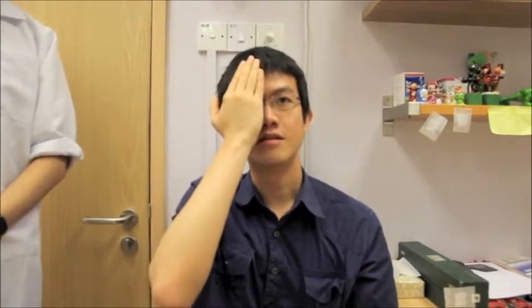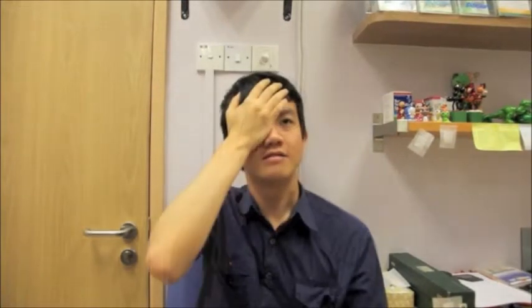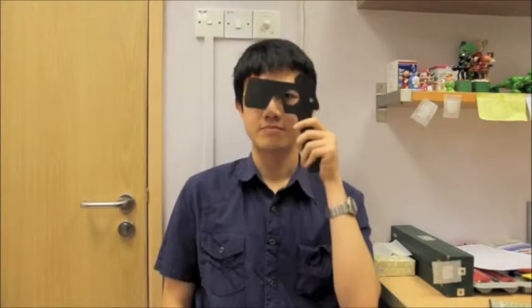Check the visual acuity one eye at a time by having the patient cover one eye while testing the other. He may use the palm but not the fingers, as one may see through the gaps between the fingers and render the results inaccurate. Take care that the palm does not press into the covered eye, as this will blur the vision when the eye is subsequently tested. Alternatively, eye occluders and pinhole masks with the pinhole lifted up can be used instead.